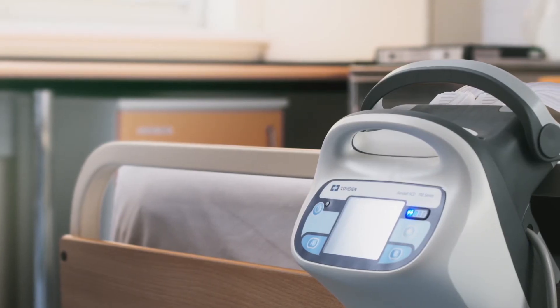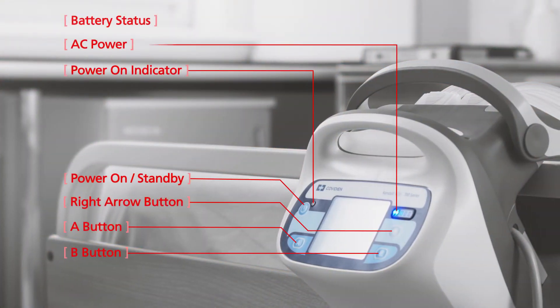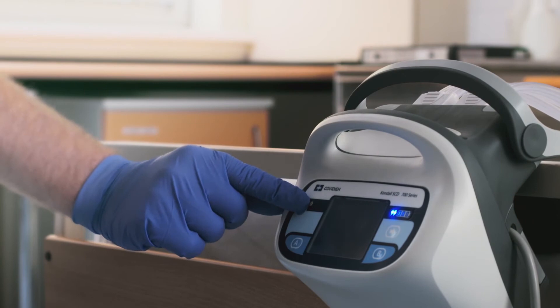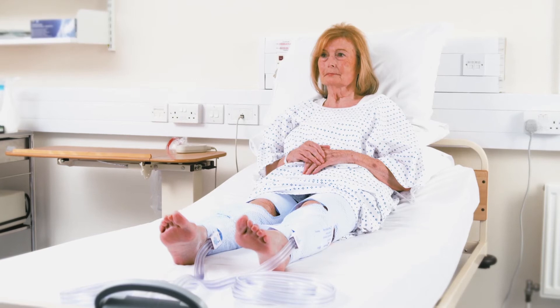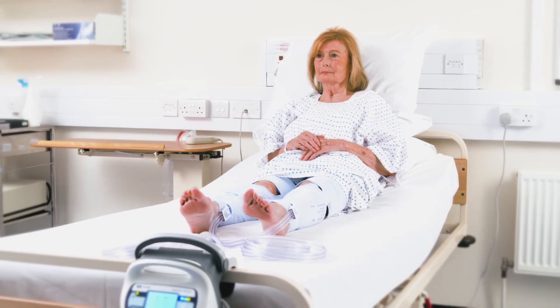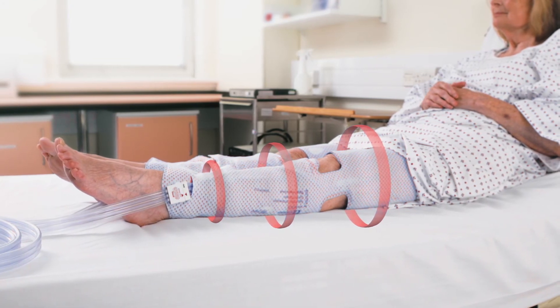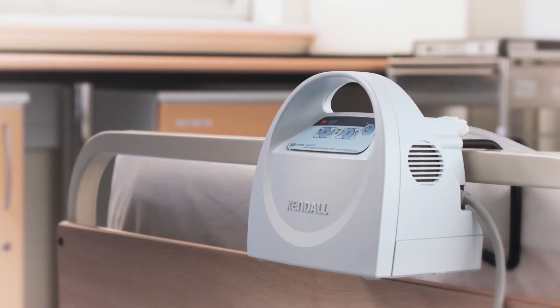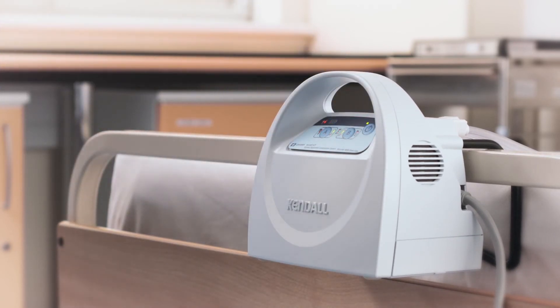The Kendall SCD700 series controller has a simple, easy-to-understand interface with four buttons and three indication spots. Press the power on/standby button to begin operation. If using leg sleeves, no further intervention is required, as the controller will automatically detect whether a knee length or thigh length sleeve is being used and then begin to deliver the set pressure pattern of 45-40-30 mmHg. The same one-touch start-up operation applies when using leg sleeves with the SCD Express controller.